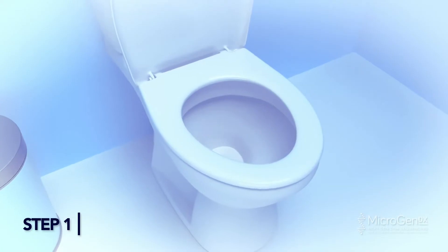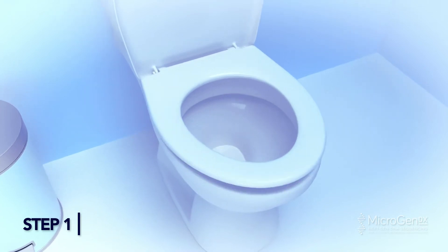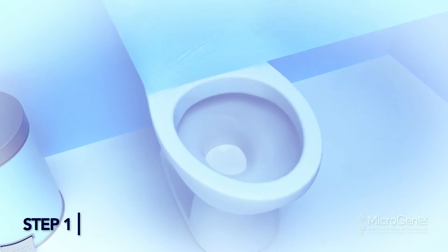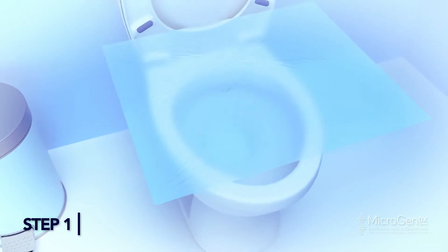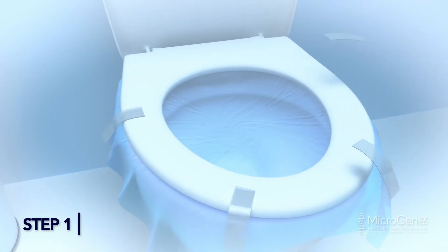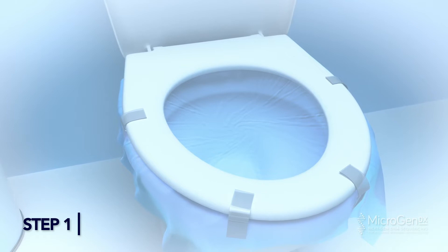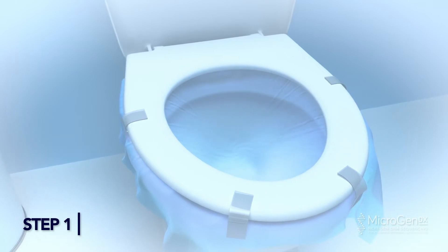Step 1: Cover the Toilet Bowl with Plastic Wrap. To use plastic wrap, lift up the toilet seat and then place the plastic wrap across the toilet bowl. Close the toilet seat on the plastic wrap to help secure it. You can also tape the plastic wrap to the side of the bowl for additional security. Before you defecate, push down on the plastic to create a small indent where the sample will collect.